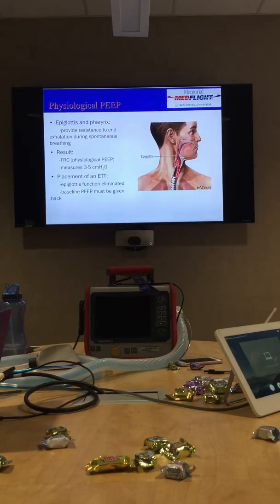I will tell you, I know that Dr. White down in ICU is using higher and higher PEEPs. And I know in the beginning it started to freak some of us out. We're like, what, are you kidding me? But research is showing that it's actually more effective. So getting that recruitment and oxygenation. So just don't be alarmed if you're seeing PEEPs of 10, 12, correct me if I'm wrong, maybe even higher.